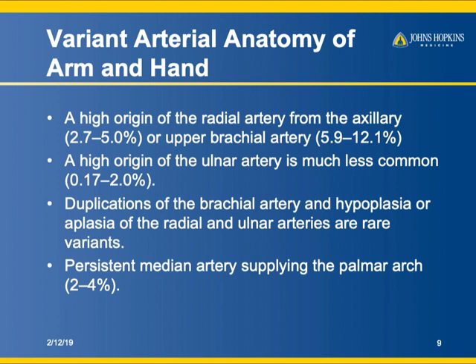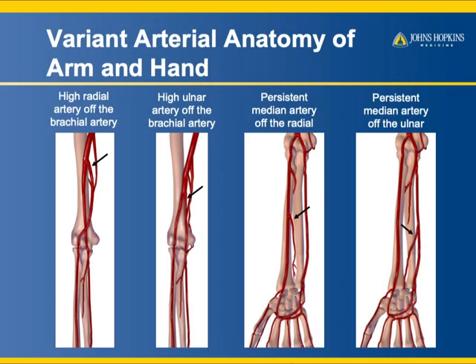Like all vessels, there are variations. A high origin of the radial artery from the axillary or upper brachial artery is uncommon. High origin of the ulnar is much less common. Duplication of the brachial artery and hypoplasia or aplasia of the radial and ulnar arteries are rare variants. Persistent median arteries supplying the palmar arch can occur in a few percent of cases. Here's a nice example of a high takeoff of the radial or ulnar artery and a persistent median artery — variations you should get used to; they're probably not going to be confused with pathology.